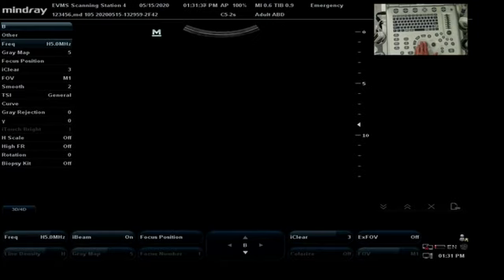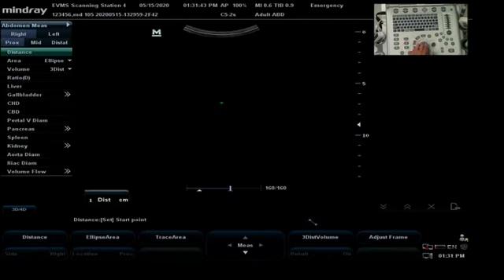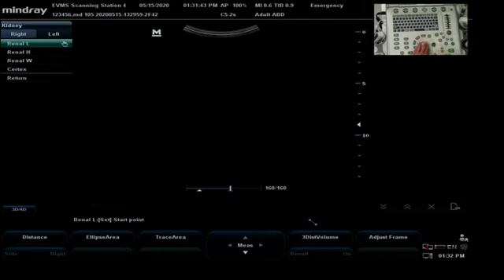The other thing you're going to see me do on this menu is once I get an image and I measure, which is over my horseshoe around my trackball, I'm going to come into my measure menu and I'm going to make sure that I am on right or left. I'm going to go to right first, and I'm going to be in the kidney first, and then I'm going to enter my renal measurements into this worksheet so that we have it as a review. This you would do clinically so that you have all your patient data together.